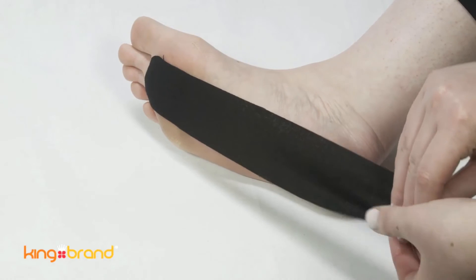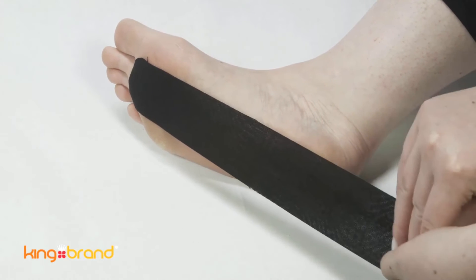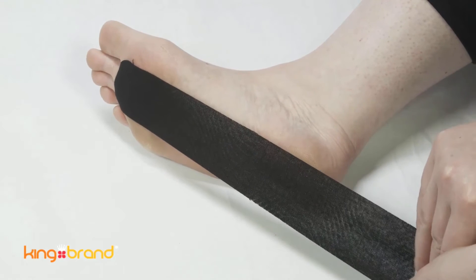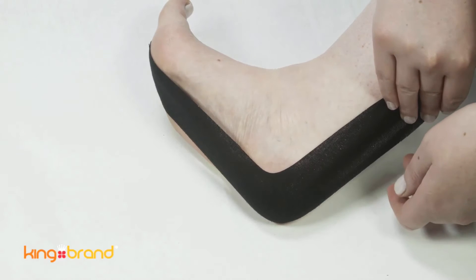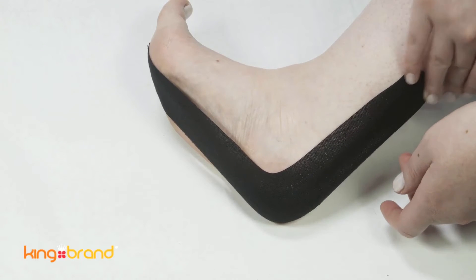Using about 50% stretch to the tape, pull the tape along the bottom of your foot and continue up the back of your heel and up the Achilles with less stretch. Make sure all the tape is touching your skin with minimal wrinkling.